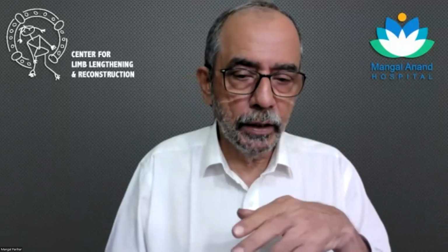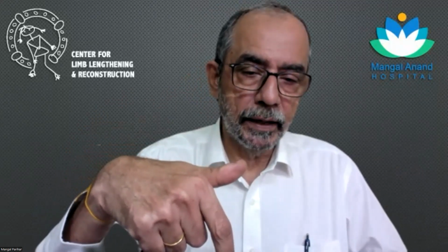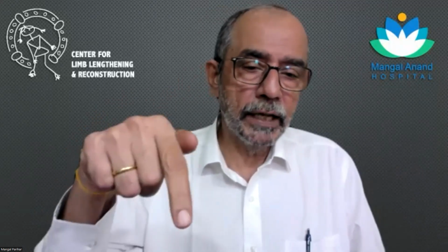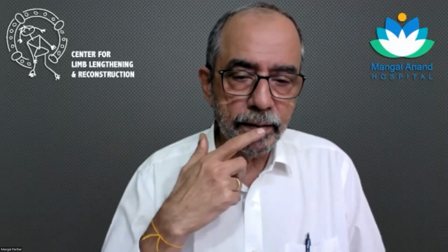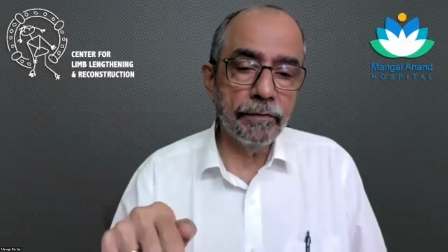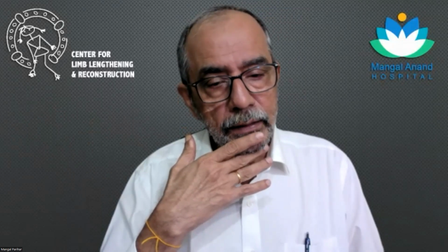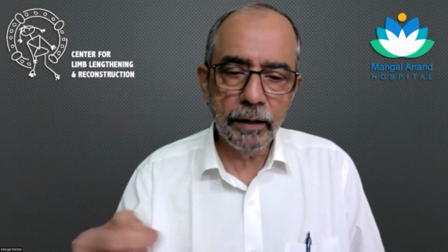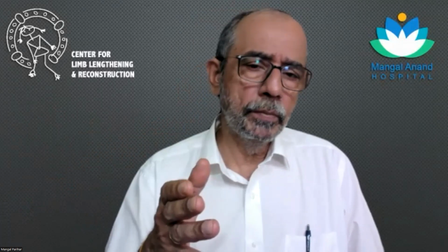And then I'll do the open wedge, and I will feel the inside. And if I feel any tightness, I'll do a pie crusting. A couple of cases, I have not hesitated to divide it completely when I was still finding it tight at the end of the opening wedge. That is at the end, after I have put my plate in. But pie crusting, if I'm finding it difficult to open, I might do even earlier.